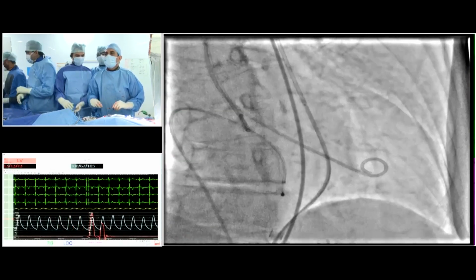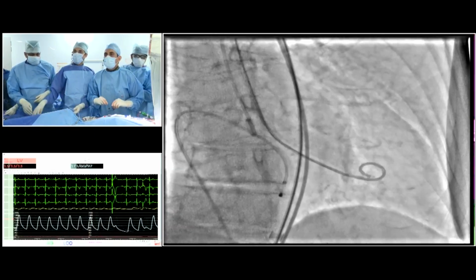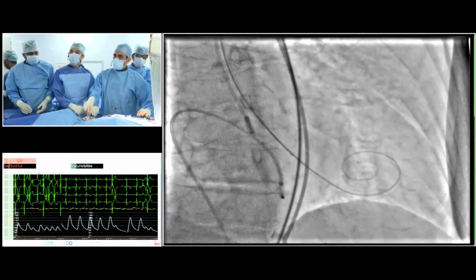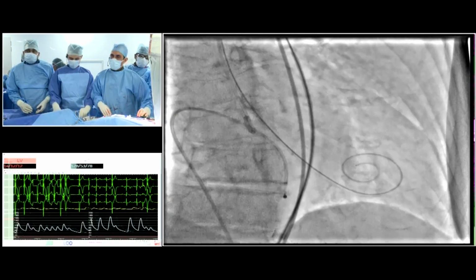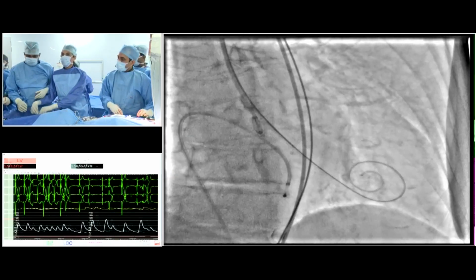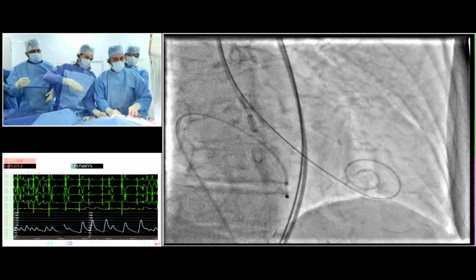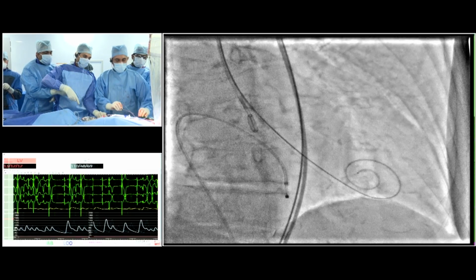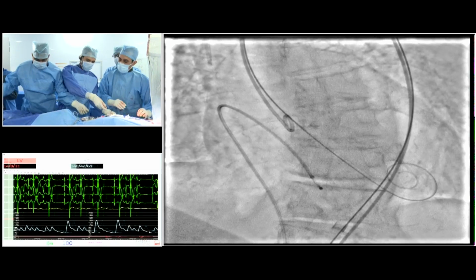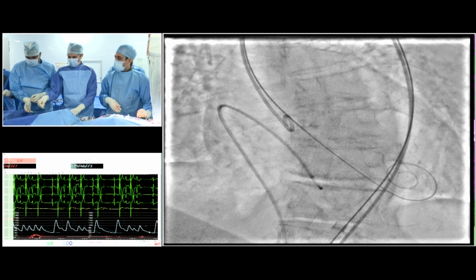The fact that they have changed for the octa-core from hexagon to octagon is quite amazing. And this technique of the interlaced struts is phenomenal. It's really very ingenious from the people in India to have created very quickly something which was never done before. I predict that it will be a successful device worldwide. Let's have the valve, please.